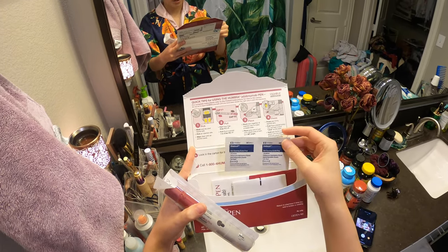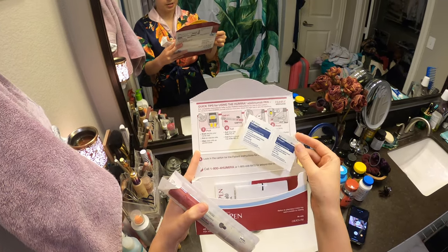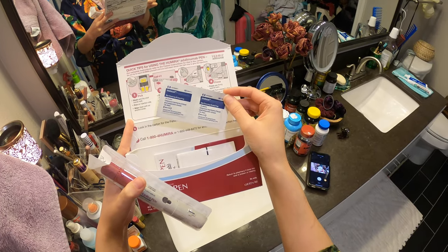Each pack comes with alcohol pads. The first time I ordered this, they asked me if I wanted alcohol pads, and I said yes — not realizing that they come with the Humira. So I'm not ordering them separately from now on.